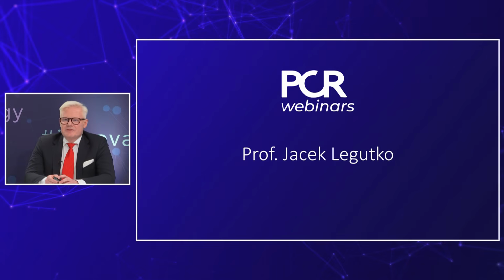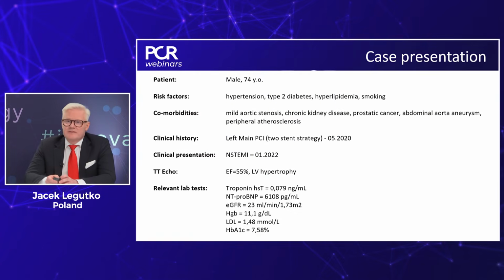But let's go to the last part of our pitfalls. I showed cases of stent deformation with compression, but sometimes we realize, sometimes even at follow-up, that we can have stent elongation and protrusion. So Jacek, please share your case with us. Yes, the number of left main PCI procedures is going up, so I believe that we will have more and more such cases, which I would love to present at the end of this webinar.